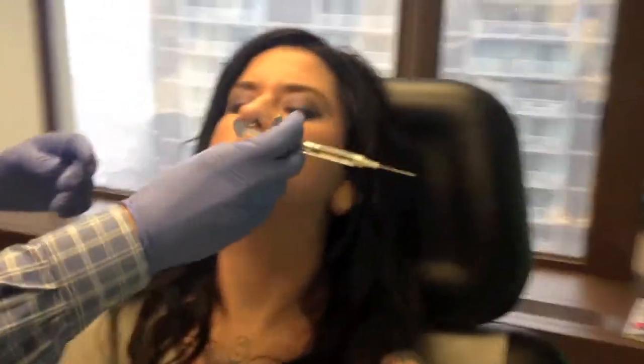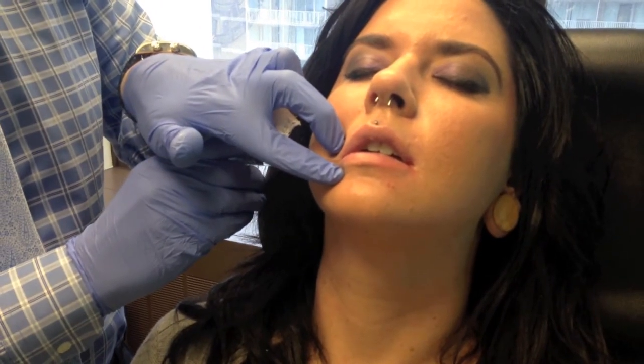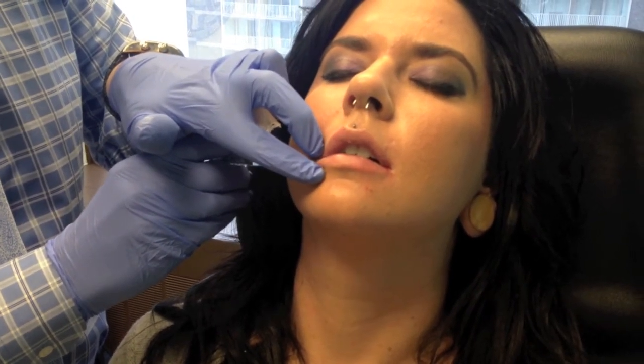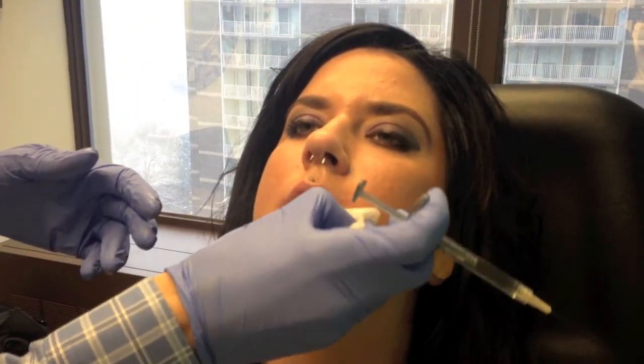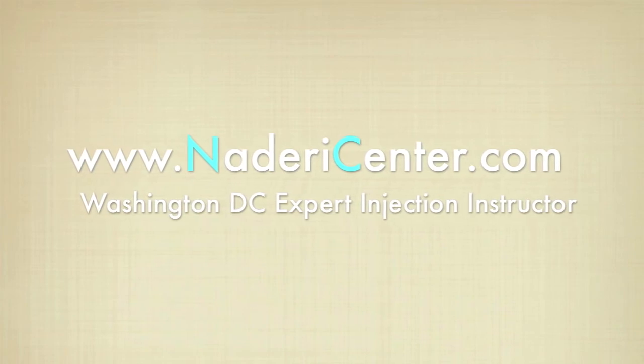That's the beauty of Juvederm. You want to hold your mouth open just a little again. Entry point — sliding gently. The slower you go, the less pain they feel because the lidocaine starts working. Visualize the filling up. Things are starting to numb up — that's our only bleeding point. I've used half of the filler. I'm going to switch to the short needle and do a little fine tuning.